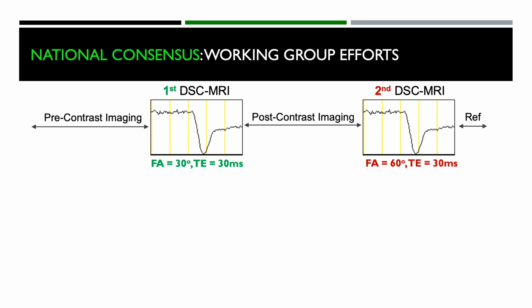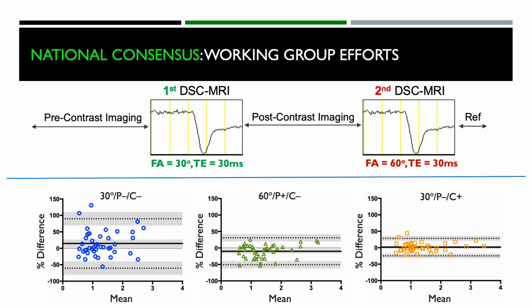So we collected the data in patients comparing the two different techniques, and we found, and these are the data plots, that this single dose technique matches what we call the standard double dose technique to an excellent degree. There's a really good equivalence here. So if someone does not want to use a double dose of contrast agent, they can go to the single dose. Even though the simulations did confirm our standard double dose method still is the most robust and clearly the most accurate, this is also a potential option.